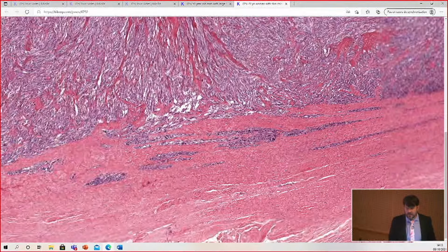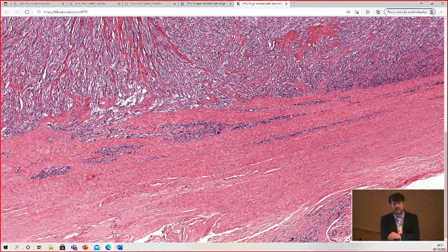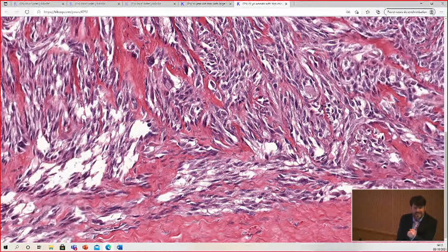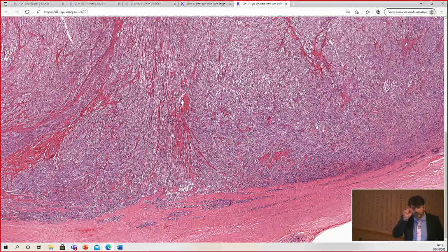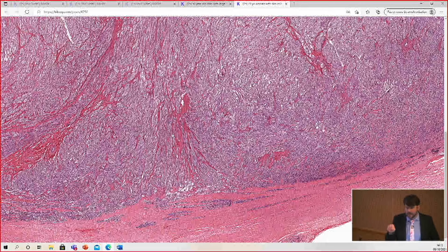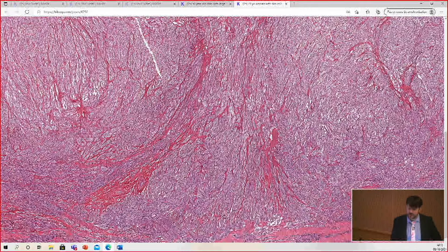For the example here, the reason we need to know is that this tumor is down deep enough that it's sitting on the tendon sheath or the fascia and directly adherent to it, attached to the collagen of the tendon sheath. Now, basic histology is always so important. Even now, all the time, one little tiny finding of histology will sometimes make the difference between recognizing that something is not a little bit of melanoma in a lymph node. So I really think you can never spend enough time learning all the subtleties of basic morphology for normal histologic structures.